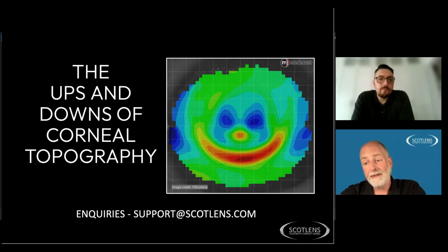You're probably going to fit a gas perm lens with a considerable apical clearance fit on a scarred cornea, because you want that tear lens to neutralize the irregularity of the cornea. That's where we rely on the information that this patient started off with symmetrical eyes. So if you've got the unscarred eye and they've had a laceration on their cornea, and you're not getting good information, you're going to say, well, their cornea in the left eye is a 770, so I'm going to start by putting in a lens that should fit that 770 and then assess it.